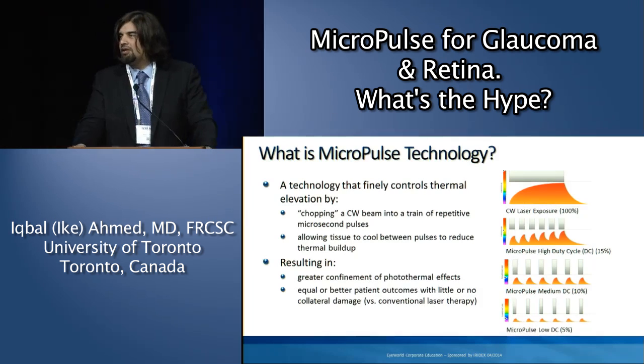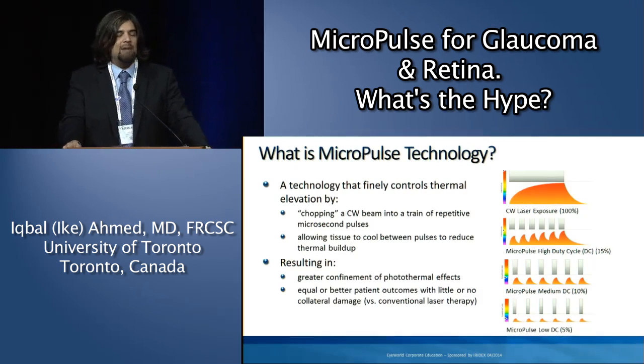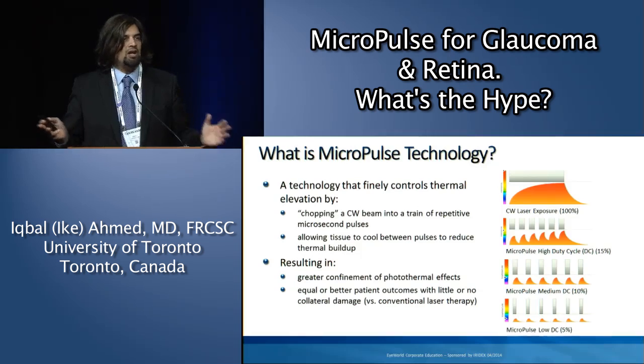Anybody who does phaco here, who understands hyperpulse, understands the benefit of heat reduction during phacoemulsification, which is basically almost gone away now as far as hyperpulsing phaco. So this allows us to do this. We can find the effects of the tissue we need to go at, and we can basically vary our parameters whatever we like, whatever our pulse period is, our duty cycle we can alter, and our power levels. And it gives us ultimate control on this.